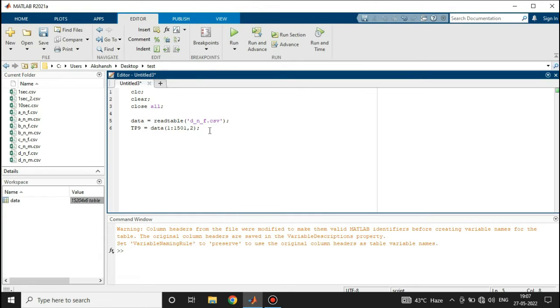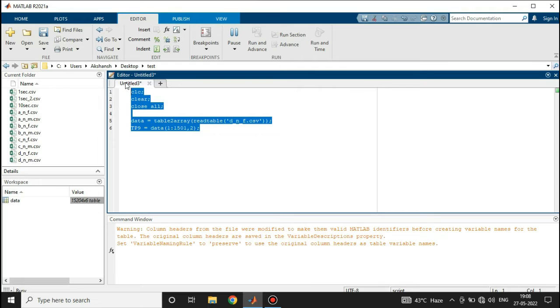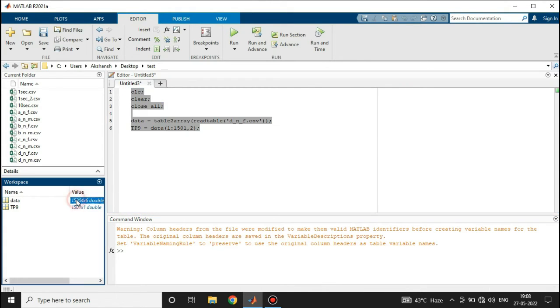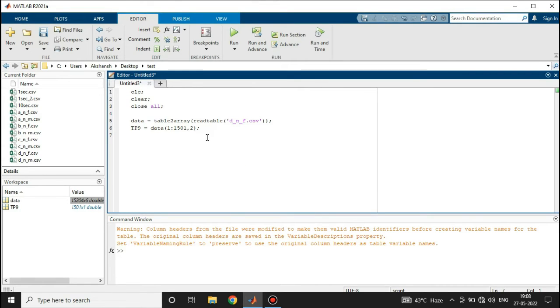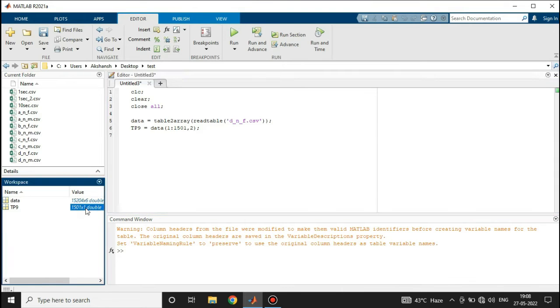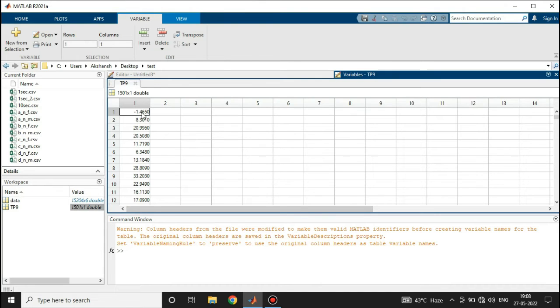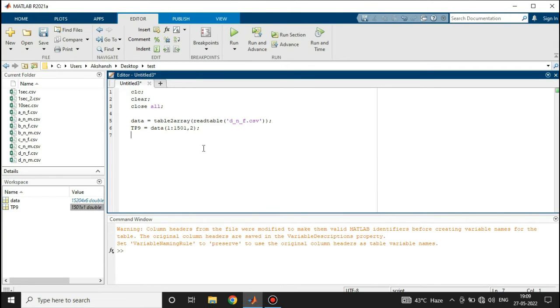At this point the data is a table, so we will convert it into an array using the command 'table2array'. Now if I run this section you can see that the data is converted into an array — we can tell because the column labels like TP9 and AF7 are no longer shown. Now we can see the TP9 values directly.